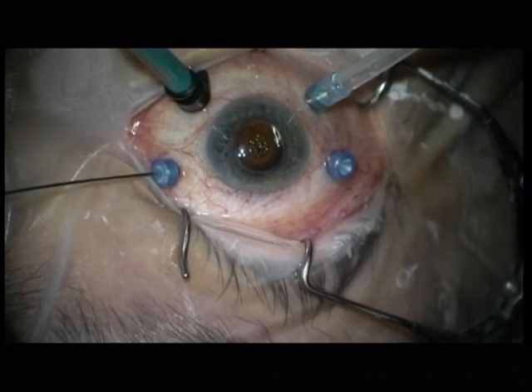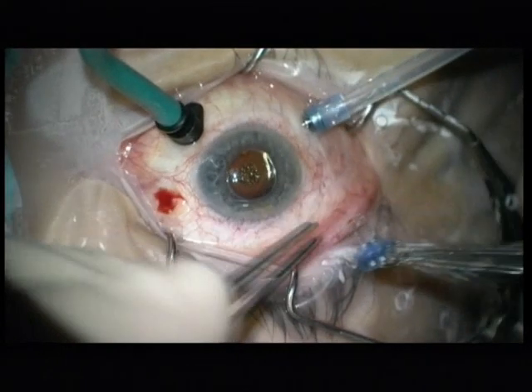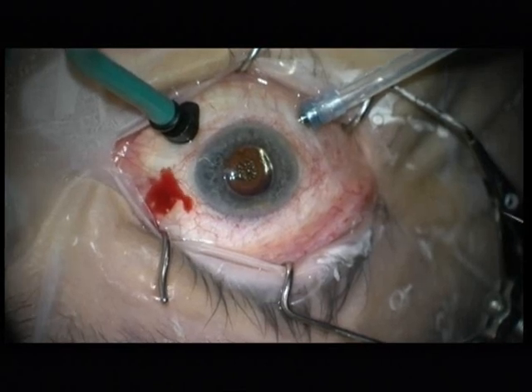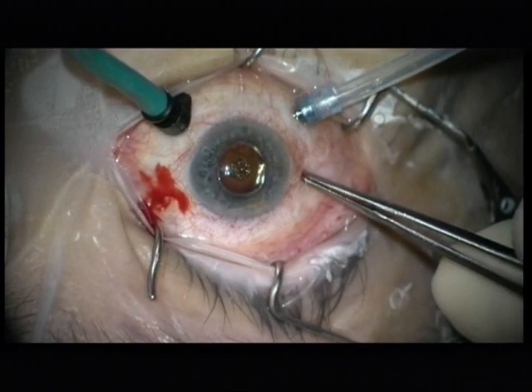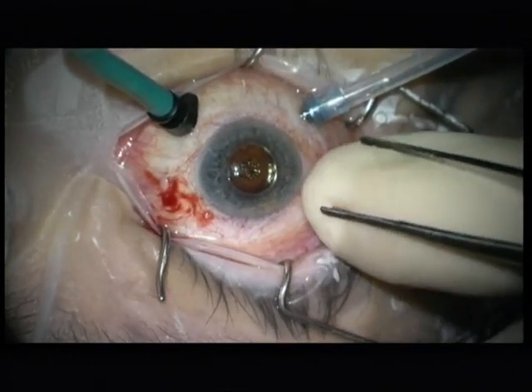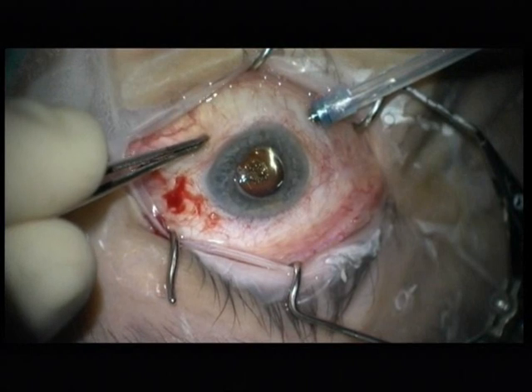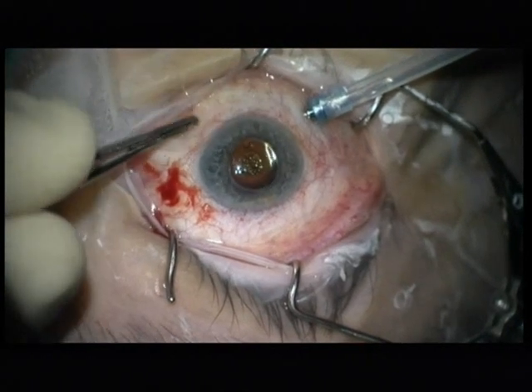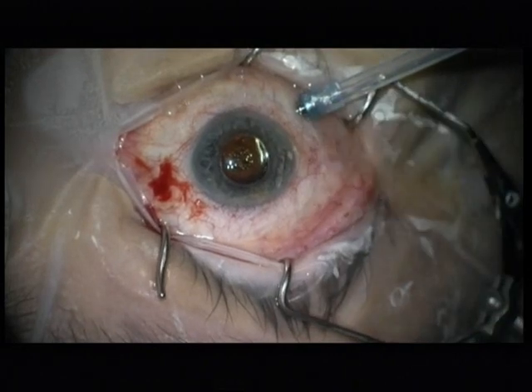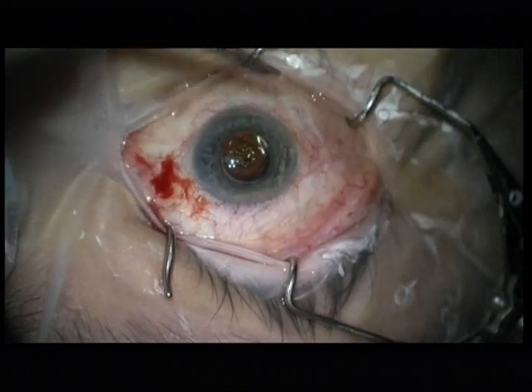Now injection of SF6 20% and removal of the trocars. This is the nicest thing about 27 gauge — it's not the surgery itself, but the postoperative behavior of the eye: good pressure, no leakage, good tamponade. Perfect for detachment surgery, and especially for detachment surgery of long eyes. I always used to suture these eyes with 23 gauge. I don't like sutures — that's why I like 27 gauge. Thank you very much.